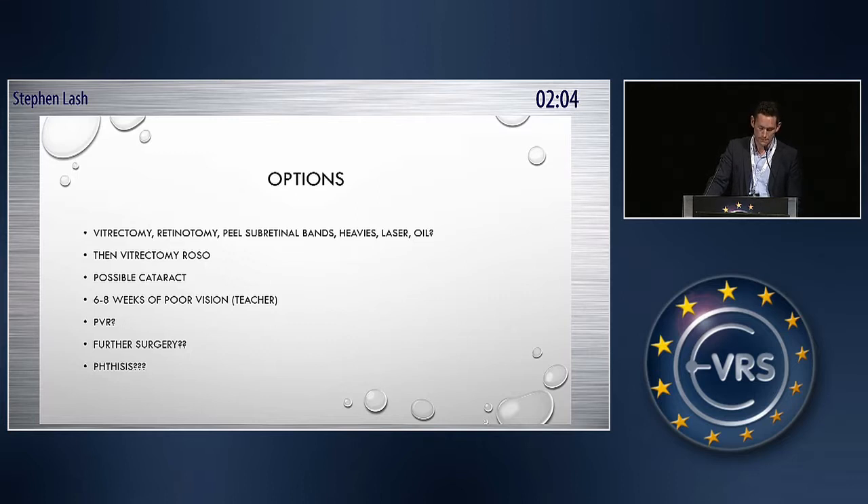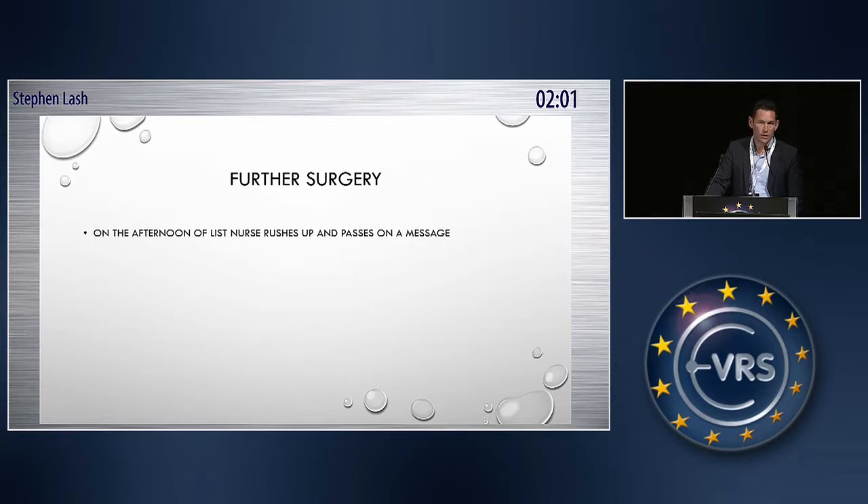Was there another way? I was on the afternoon list, and the nurse came running up to me regarding this patient, and this patient said that she wants to get pregnant. I said it was a busy list, and there was going to be unlikely any time for that. But it was actually quite useful, because what I decided to do meant that she could go and get pregnant.